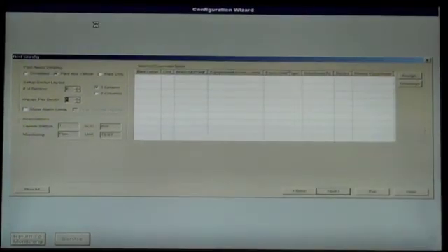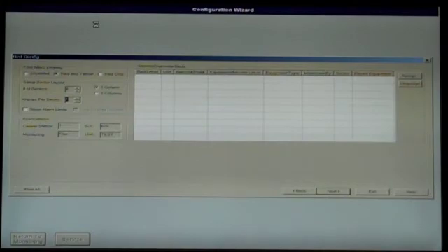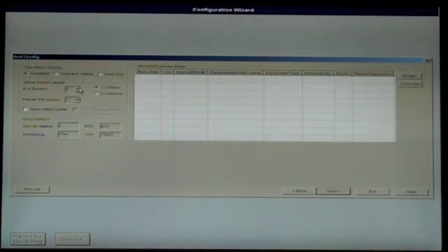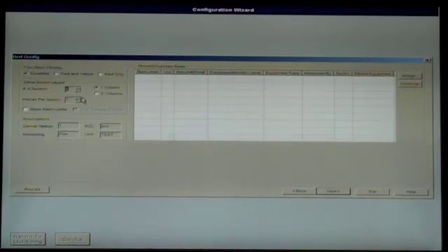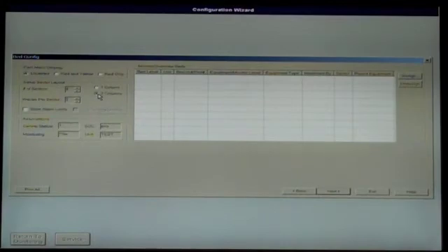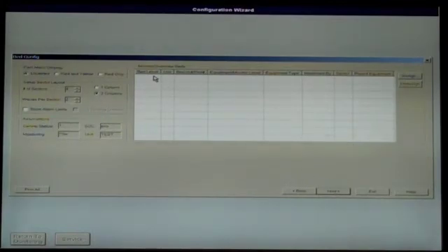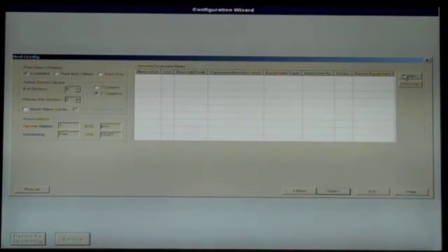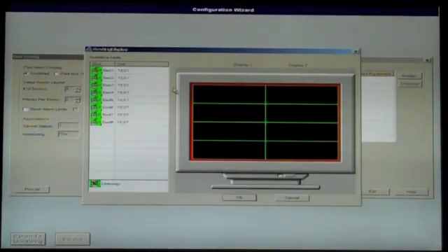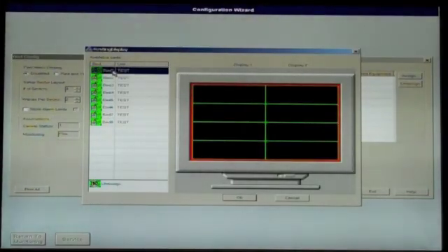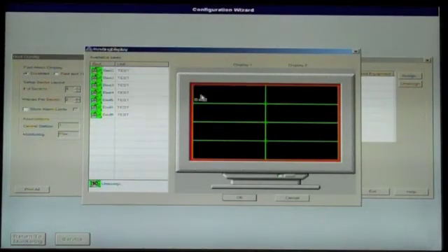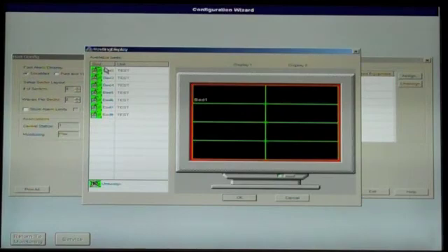The next screen is the bed config screen. Select the desired options for fast alarm display, number of sectors, waves per sector, and one or two column layout on the left-handed side. Next, assign each bed to a sector by clicking Assign, then each bed followed by the sector you wish to assign it to.